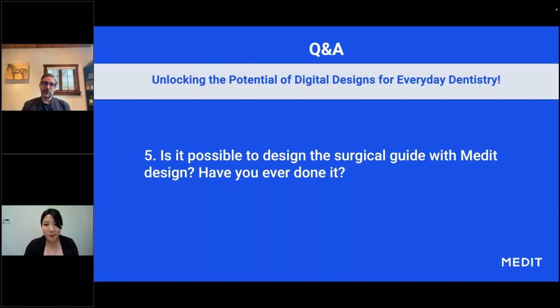But I know that you can make the non-sleeved surgical guides with Medit Design. I've watched all the videos, and I learned a lot from them about the different things you can do. For example, I used that as inspiration when I was making an implant provisional without even having the abutment, just using some of the same features and tools to make the screw access opening and everything.